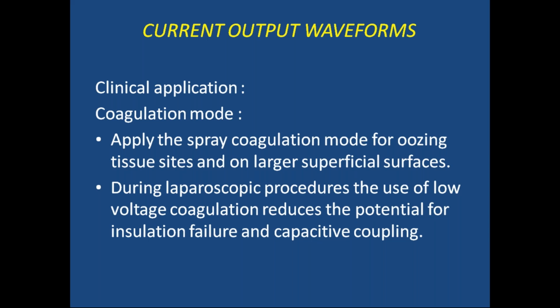So, clinical application, coagulation mode. Apply the spray coagulation mode for oozing tissue beds and larger superficial surfaces. During laparoscopic procedures, the use of low voltage coagulation reduces the potential for insulation failure and capacitive coupling.